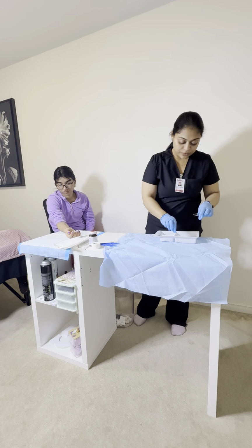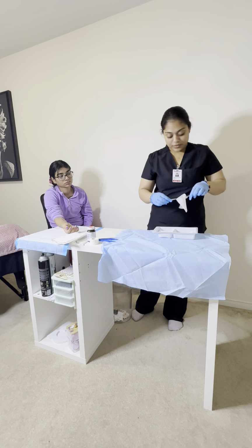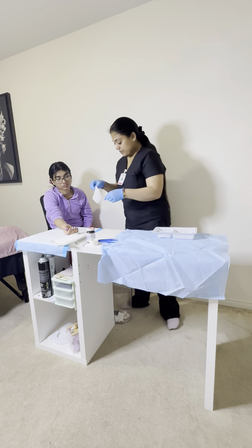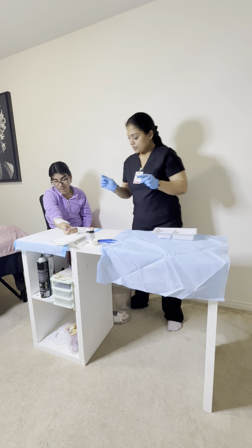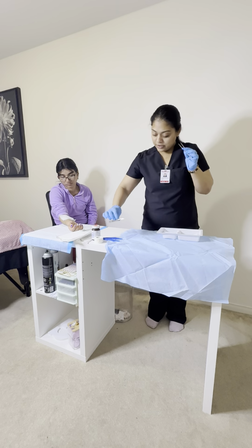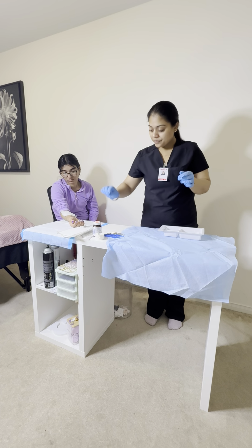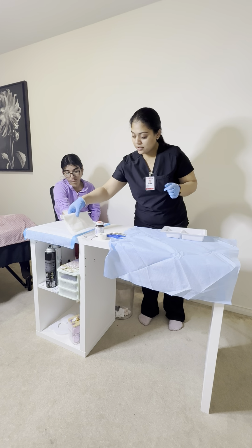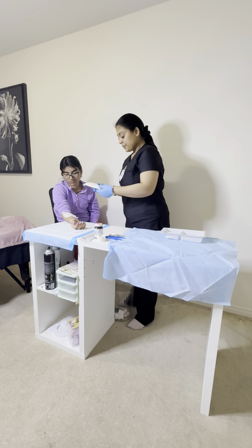Now I'm going to use 4x4 gauze to cover the wound. Now going to put the forceps at the edge and take the sterile bandage to secure the wound.